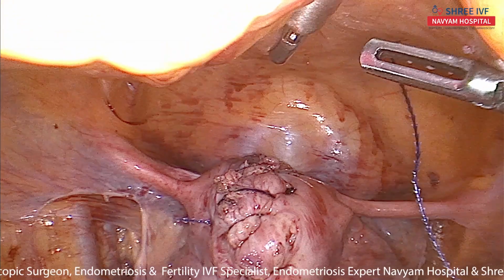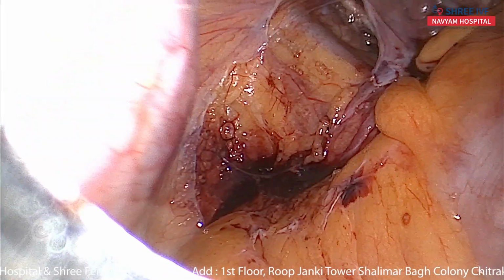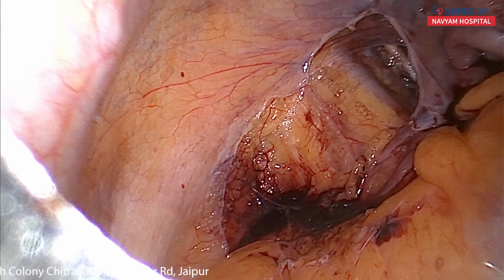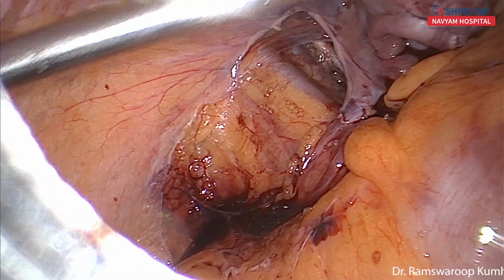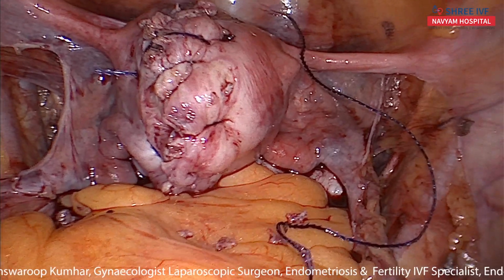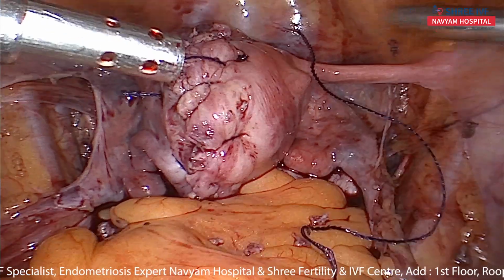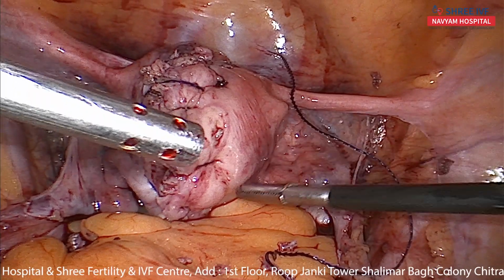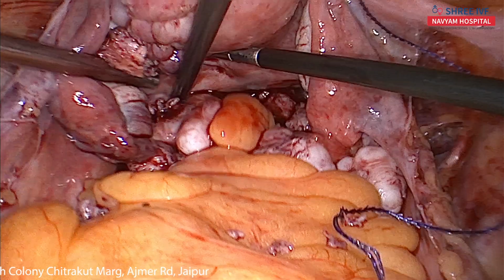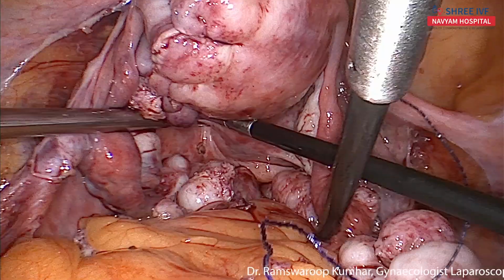No. Flexion, please. And morcellation ready. Now this is the final picture. Now we will proceed for the morcellation of these fibroids. That will take longer time, so we don't want to continue it live.